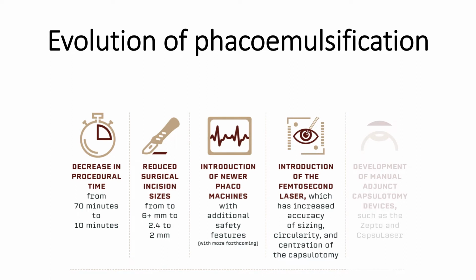Now, in recent times, we all have heard about femtosecond laser, which has increased the accuracy of the sizing and the repeatability of the incision and capsular access, which has enhanced, although it has not stood the test of time. And ultimately, reports are there which say that there is actually no difference in the outcome of the patients who are operated using femtosecond laser and routine phacoemulsification surgery.